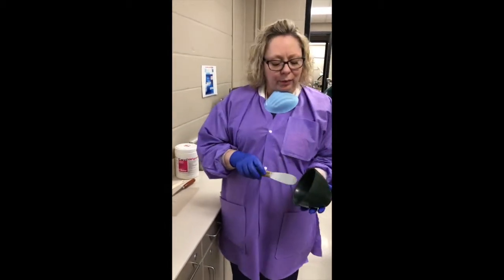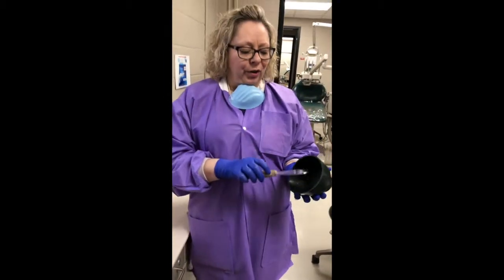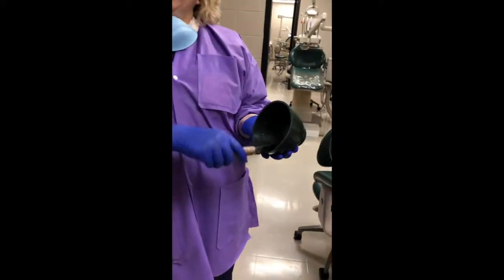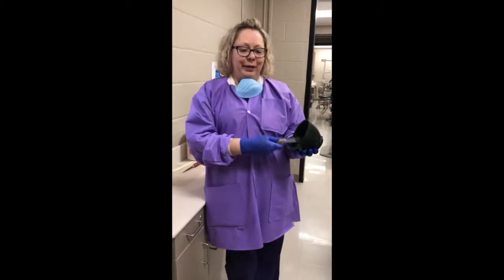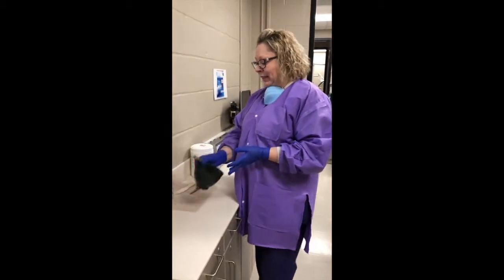And so when we mix the powder and the water together, we turn the bowl on its side and go back and forth, which is an action called spatulate. This is probably the only time you'll ever use the word spatula as a verb, and we spatulate the product inside there to mix it nicely.